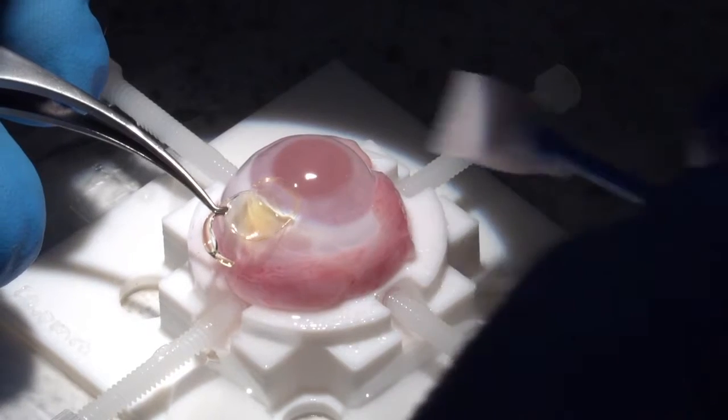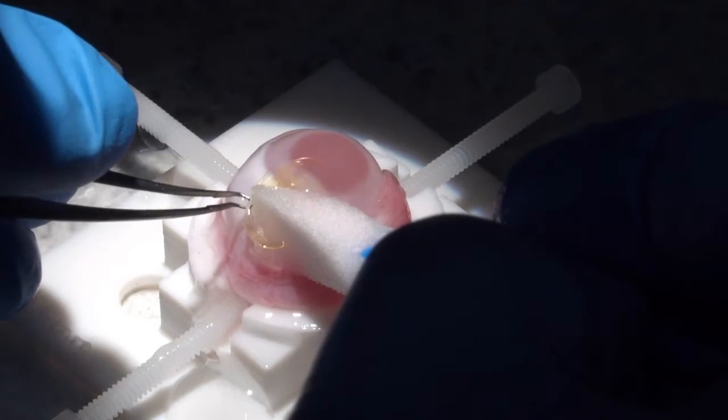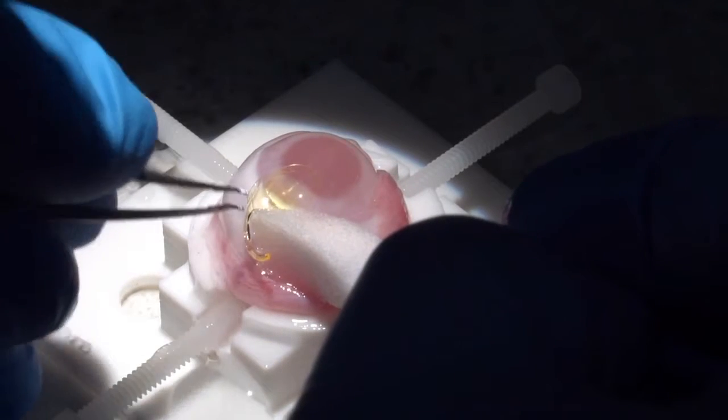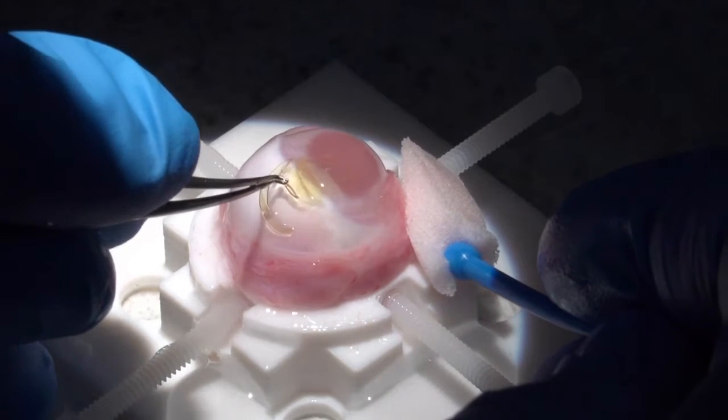Without folding it, we're going to see if we can slide this lens in due to the delayed unfolding properties of this specific lens that we have.